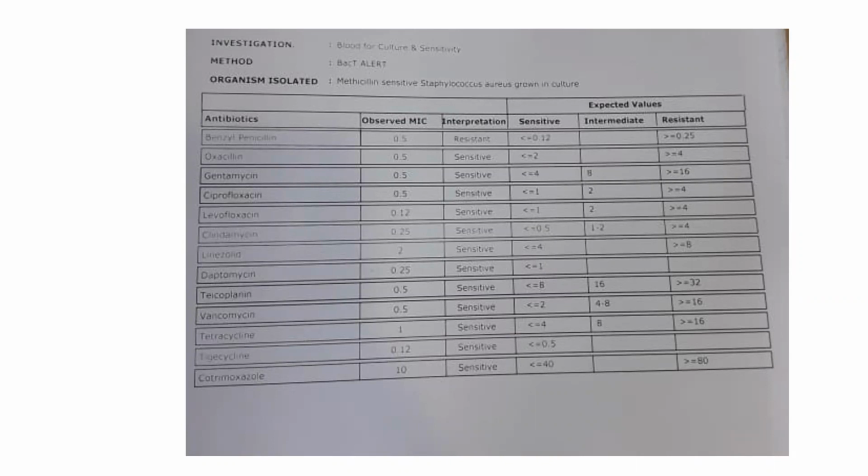And each of these steps is important for me to decide whether I need to change my antibiotic, whether my antibiotic is correct. Do I need to modify my antibiotic based on the available information till that point, till I get the final sensitivity? So all these things are done. And then once the colony is grown, it goes into the Vitek machine for the automated sensitivity. And then Vitek also identifies that bacteria.